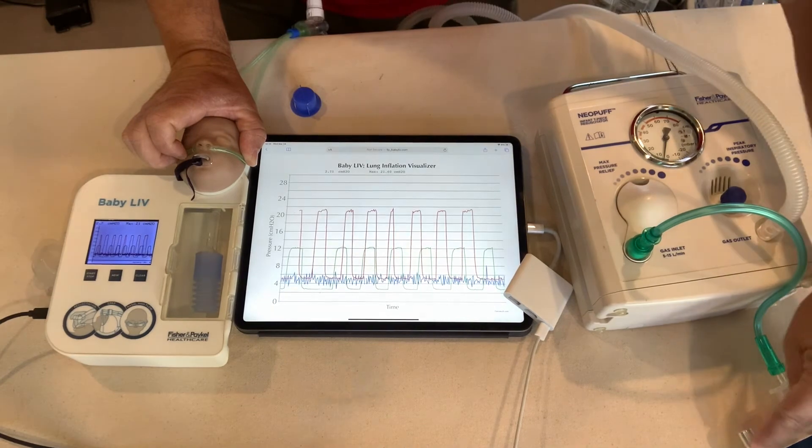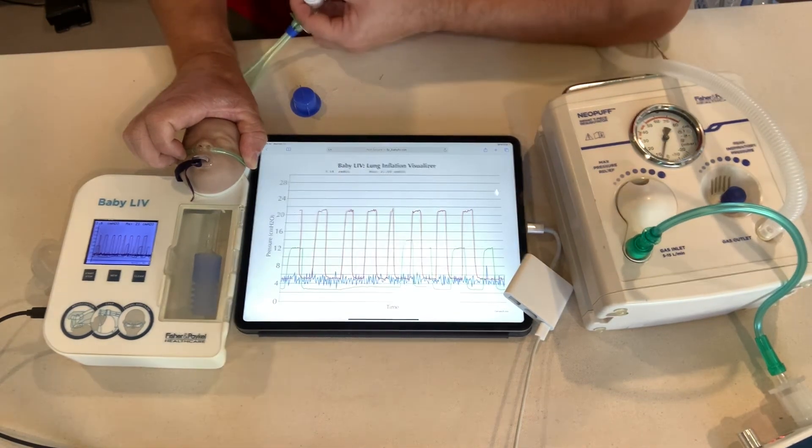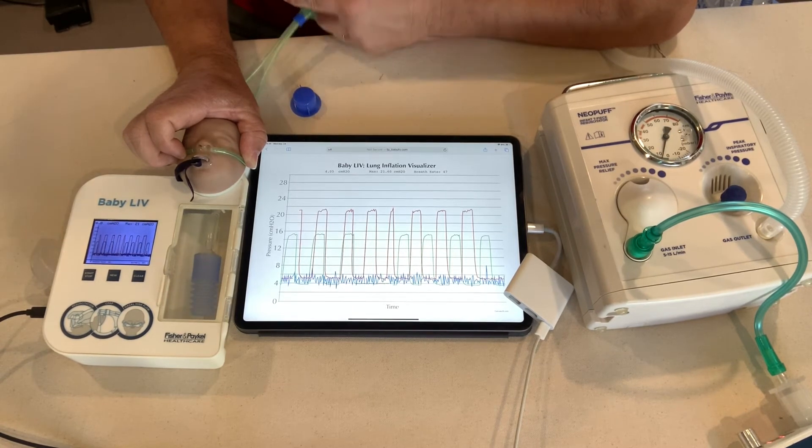Some people cheat a little bit — increase the flow to get back to 20 over 5 on the Neopuff. But if I look at what's going on internally in the Baby Live's mechanical lung, even though I increased that to 20, I'm still only getting 15 over 3 — a PIP drop of 5 and a PEEP drop of 2. That's less than what I want to give the baby.